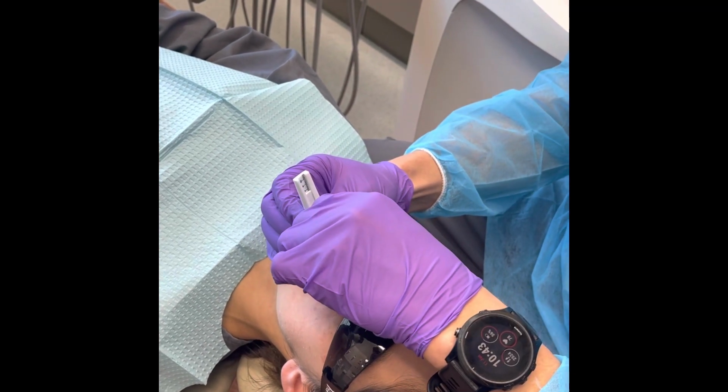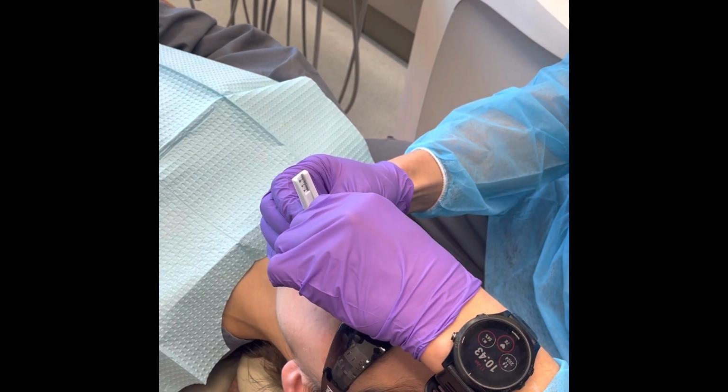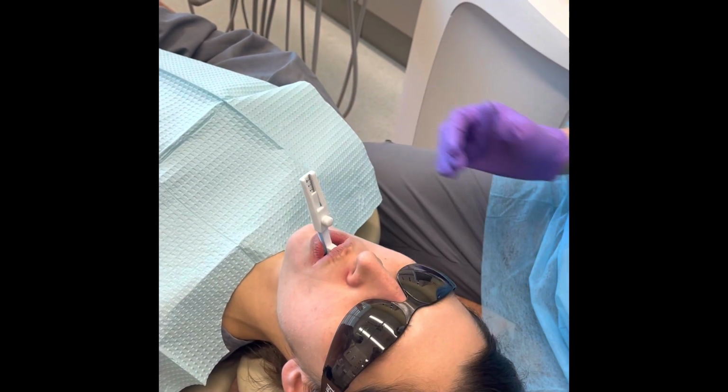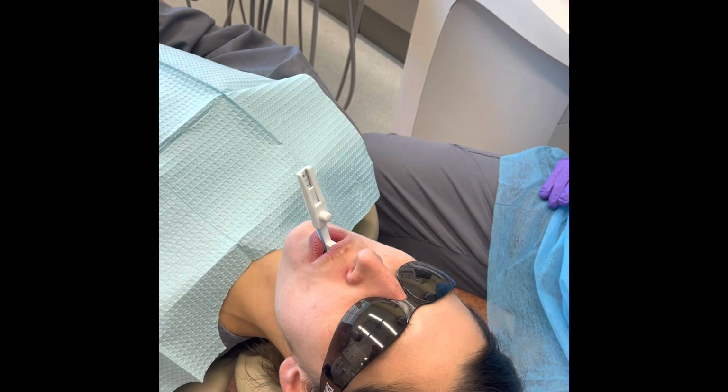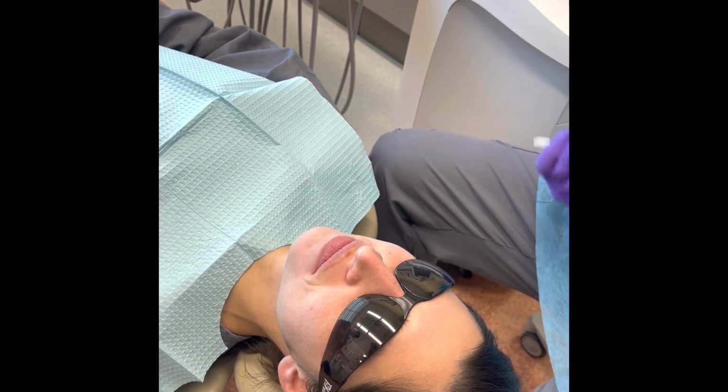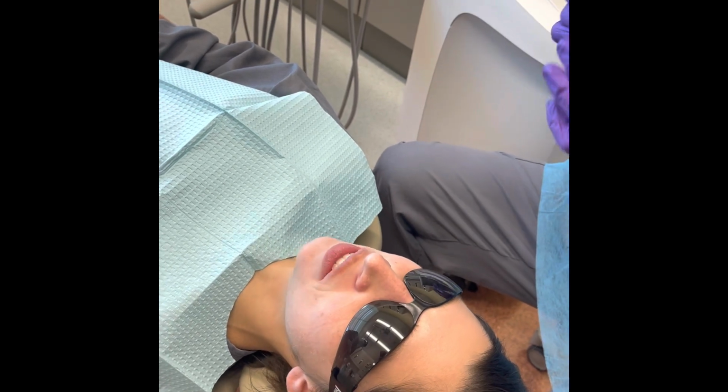All right, I'm going to try one more time. Go ahead and slide a little bit further forward for me. A little further forward, and stop right there. And go ahead and try to make the snoring sound again. A lot harder, right? Mm-hmm. Open up for me. Do you feel like you have to really kind of force it to try to make the snoring sound? Yeah. Okay.